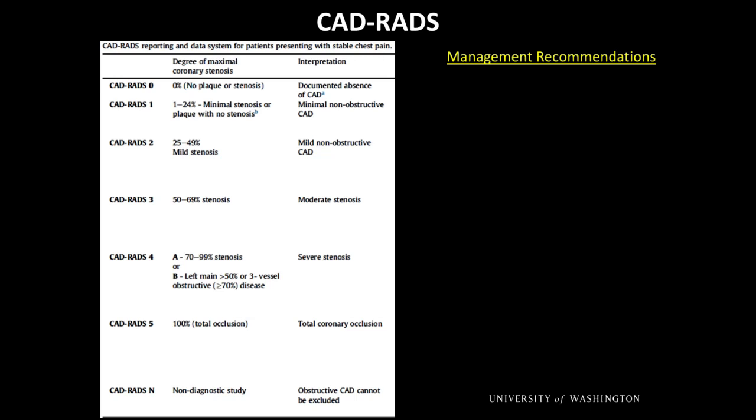And this is the standard reporting system called the CAD-RADS. And what it does is it systematically pairs the severity of disease with specific management recommendations. I don't think this applies necessarily to the cardiology audience here, but maybe to the primary care person who's referring the patient, this may be more helpful. But we can see with an increasing CAD-RADS score that the severity of coronary artery disease worsens.